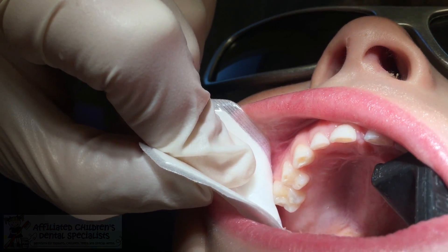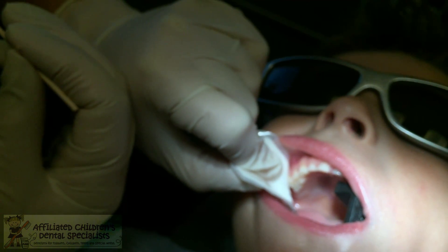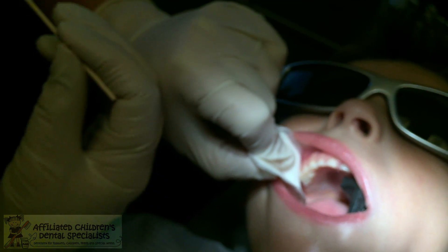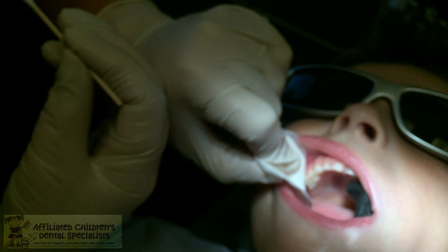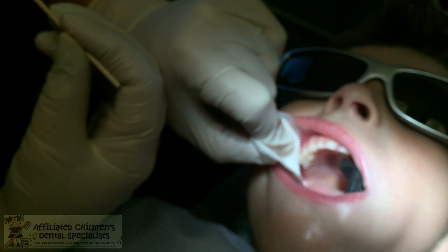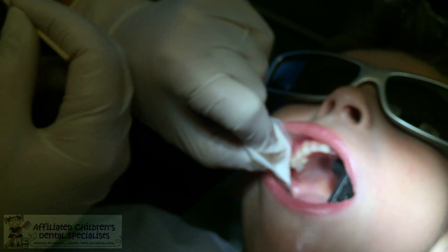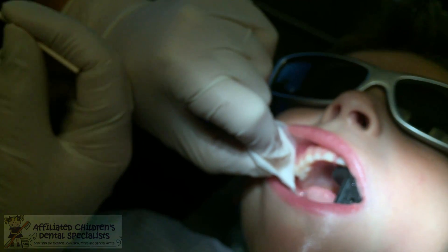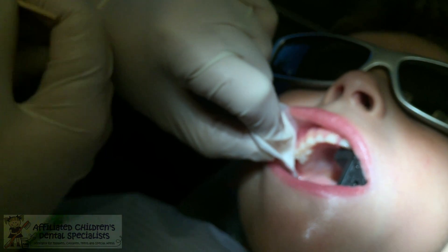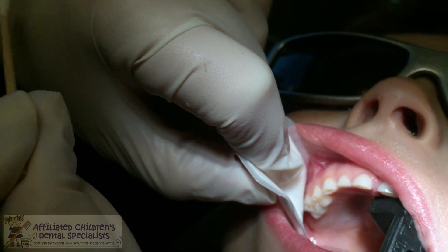When it's in place, we have a two-and-a-half minute timer counting down. And because this is a Same Day Smart, I am not going to place the Fuji Coat over the top because that requires light curing and I don't want to light cure my SDF. Number one, it won't allow deeper penetration of the silver into the dentinal tubules. Number two, I don't want to turn the entire tooth black. With Same Day Smart, this glass ionomer cement will eventually turn gray, so it's important for the child and the parent to understand that's expected and normal — it'll be a pale gray, lighter actually than an amalgam filling. There is a way to prevent that: stage out the SDF at the exam and then place the glass ionomer cement after the caries is already arrested, two to four weeks later — the cement would actually stay white. In this case, I'm going to place a little bit of Vaseline over it just to help seal out the saliva and help the glass ionomer cement reach its ideal setting properties.